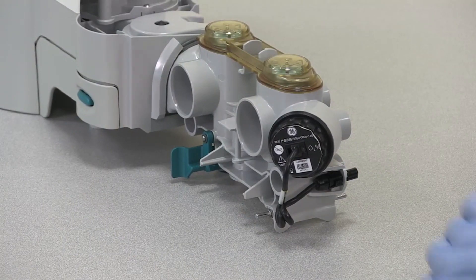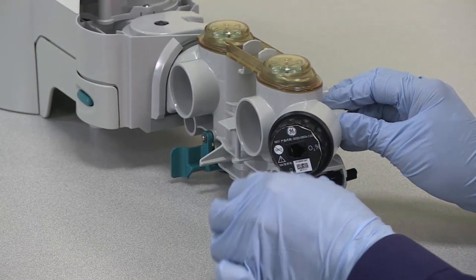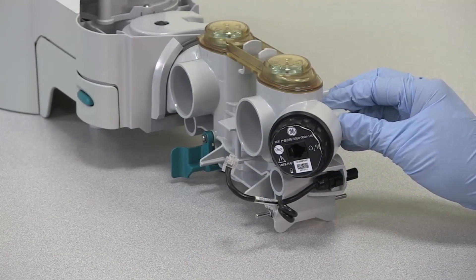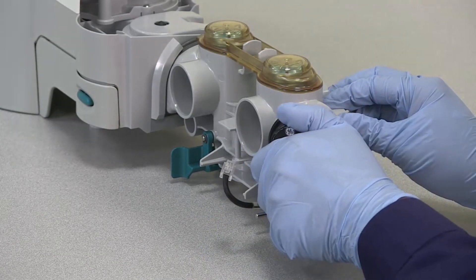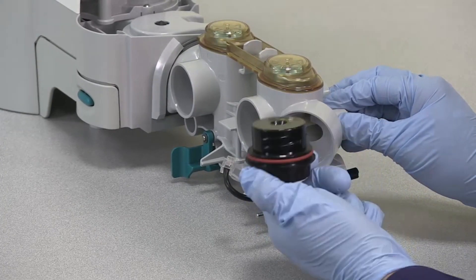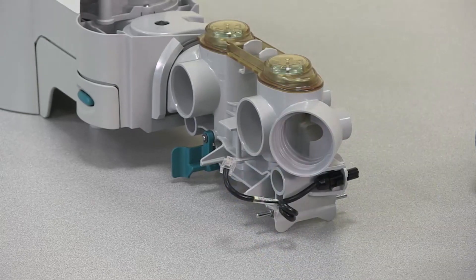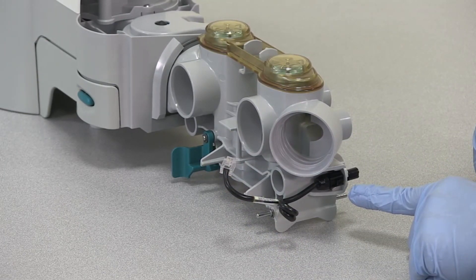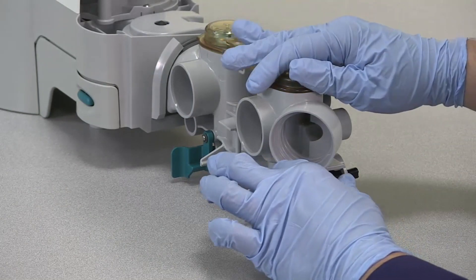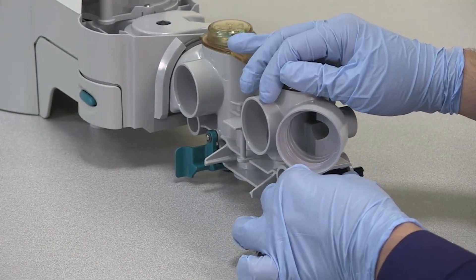To remove the circuit O2 cell, first remove the O2 cell cable from the cell. Unscrew the O2 cell counter-clockwise and remove it. Disconnect the O2 cell cable from the breathing system by pressing on the connector button while pulling the connector out.